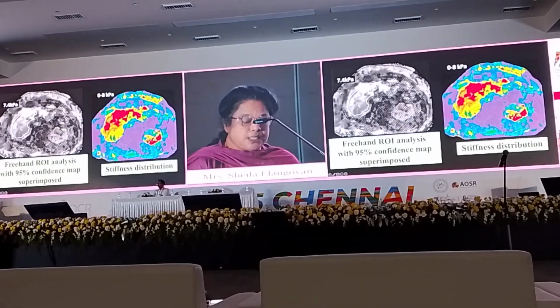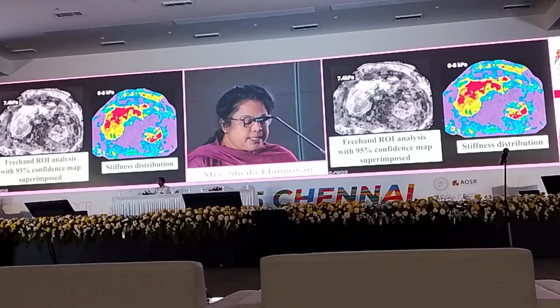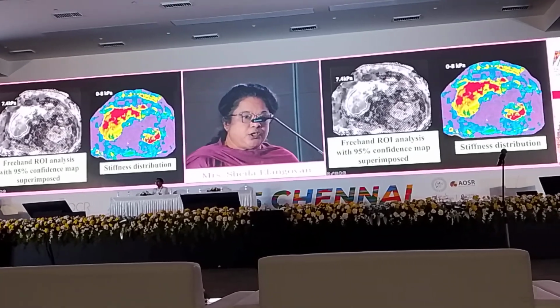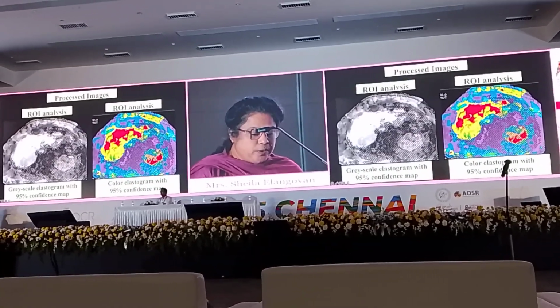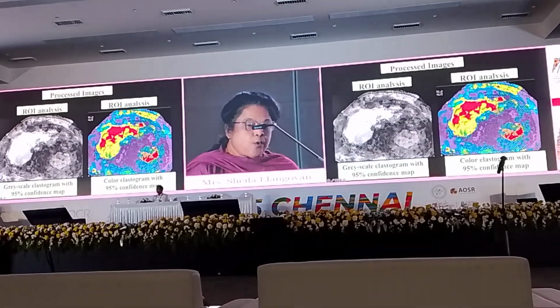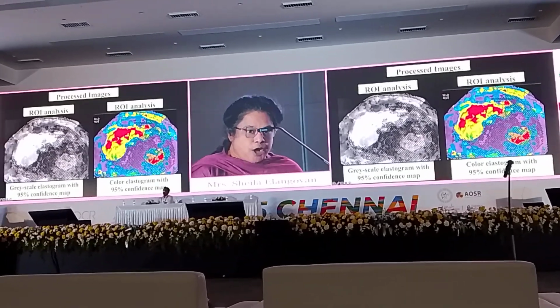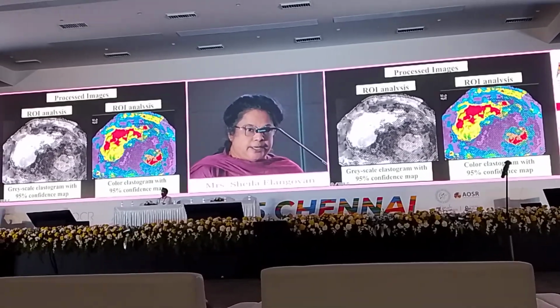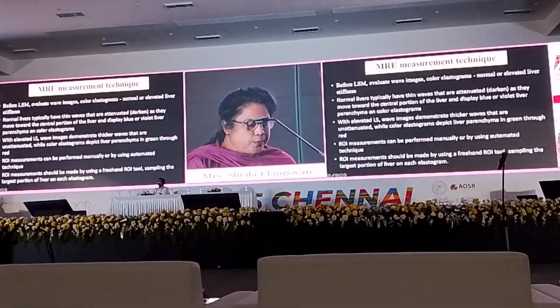Now why is this important? When you draw an ROI, you should see that it does not overlap the cross-hatched areas. If you see here, this cross-hatched area, so when your ROI is drawn, you should avoid such areas because there is poor wave intensity, distorted waves and hotspots are there. So all that will influence your value, so you should avoid that. So how do you do it?